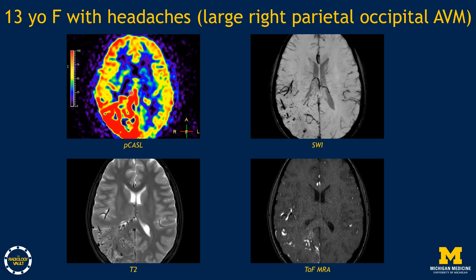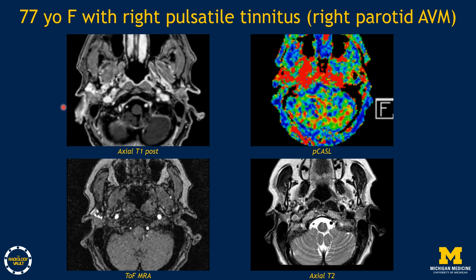ASL can also be used for vascular malformations. In the right parietal occipital region, there is elevated blood flow compared to the rest of the brain. SWI shows high susceptibility throughout with lots of T2 flow voids and increased vascular structures on time-of-flight MRA, consistent with an AVM. This is also a patient with right-sided pulsatile tinnitus showing an enhancing lesion in the right parotid gland with increased flow on ASL, increased vascularity on time-of-flight MRA, and a flow void — consistent with a right parotid AVM.